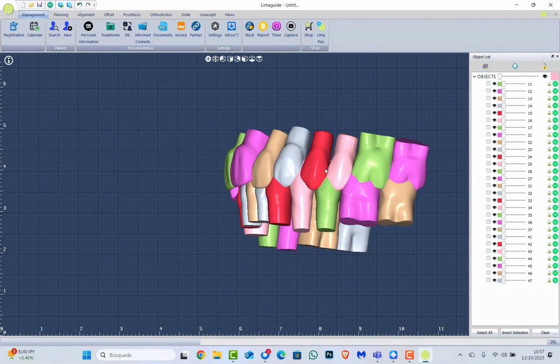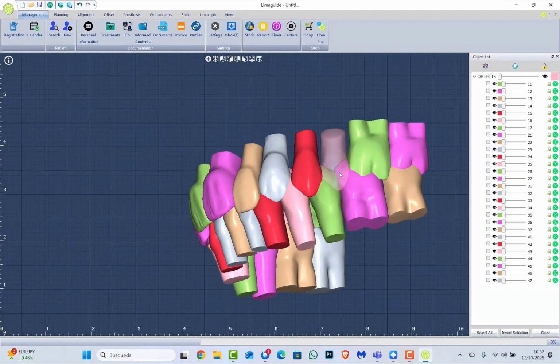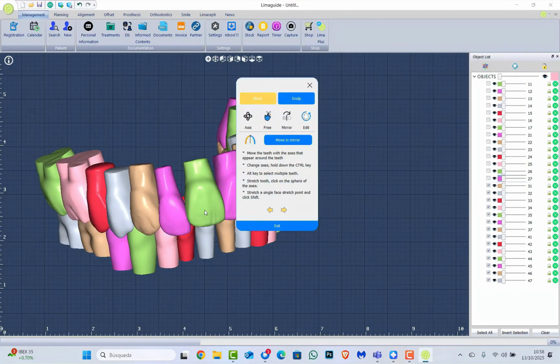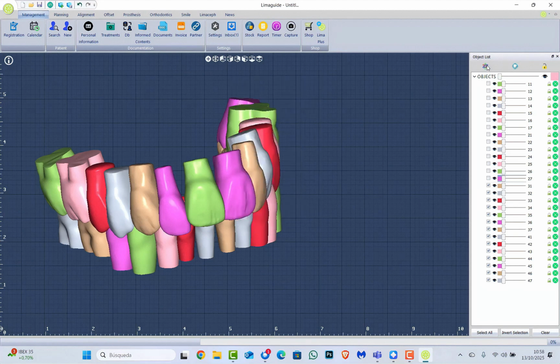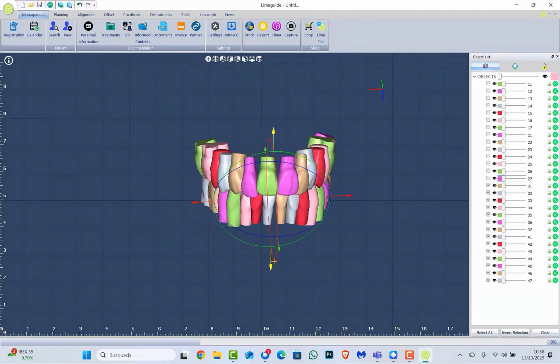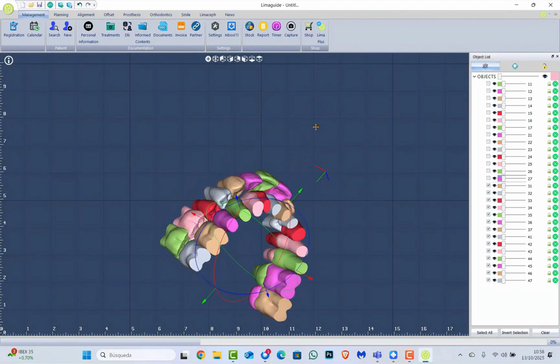However, I see there's some kind of overlapping between these two, so I'm going to select the inferior teeth and I'm going to move them all together. It's important to move them together. I could actually move them one by one, but we advise moving them together. Remember, by the way, that here in Limaguide, each tooth is a separated STL. So why should we remember that? Well, if for example, I click here, I won't be able to move all the teeth. So to move all the lower teeth, we are going to click here on the atom. And with this tool, we'll be able to select everything and move all the lower teeth together.